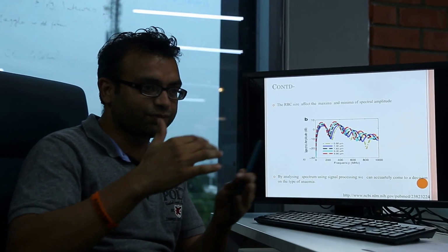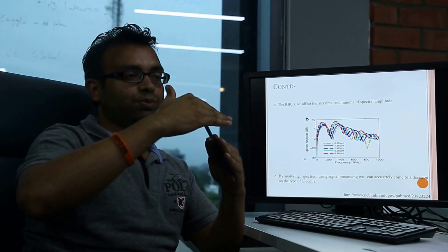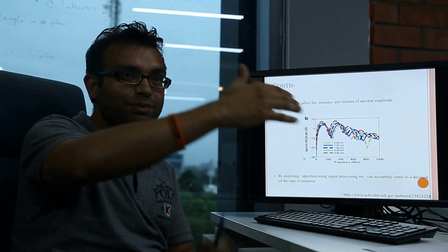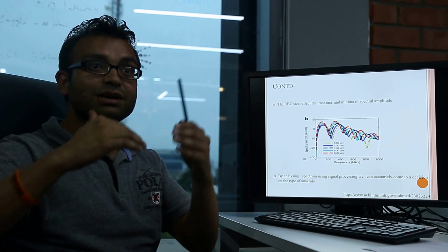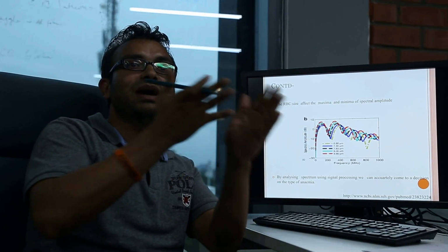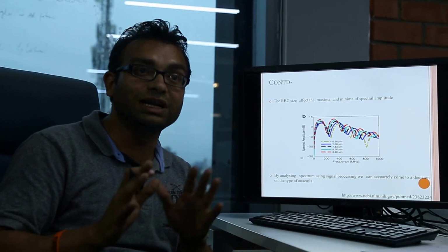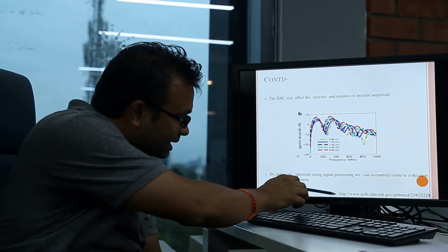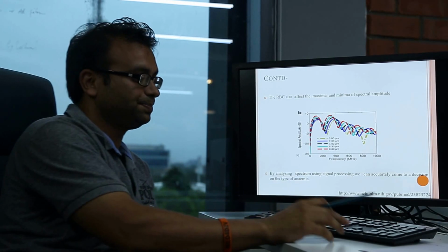So we can normalize with the condition so that above the normal size of the RBC can be considered megaloblastic, and below the normal size of the RBC can be considered microcytic. So like that we can differentiate between megaloblastic and microcytic anemia, which are the most common causes of anemia. We can see the reference is also given here.